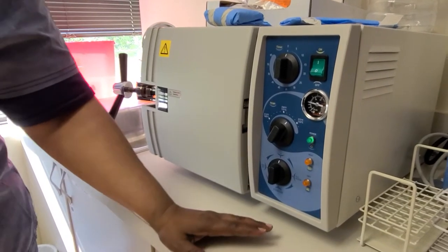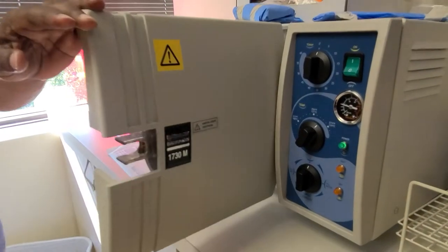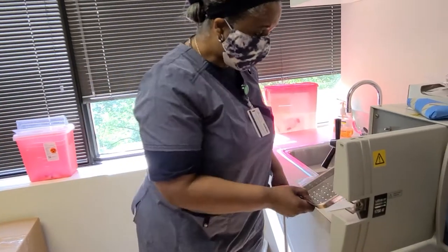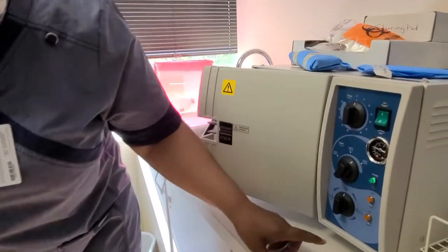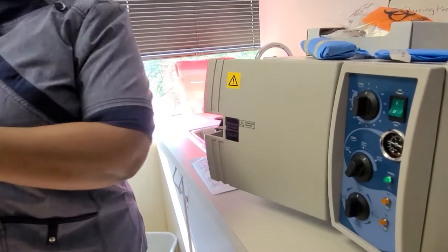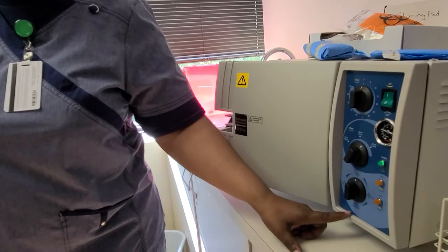Now, I'm going to explain before I turn because I don't want the water to overflow. Where it says fill water, once I turn that on, I'll be able to see when I take my tray out that the water is going to start to come out of the hole at the bottom. When it does that, to make it stop, I have to turn it to sterilize. I wish it said stop the water. I wish it said something like don't do any more, but it doesn't. So we have to know that sterilize means stop the water, okay?